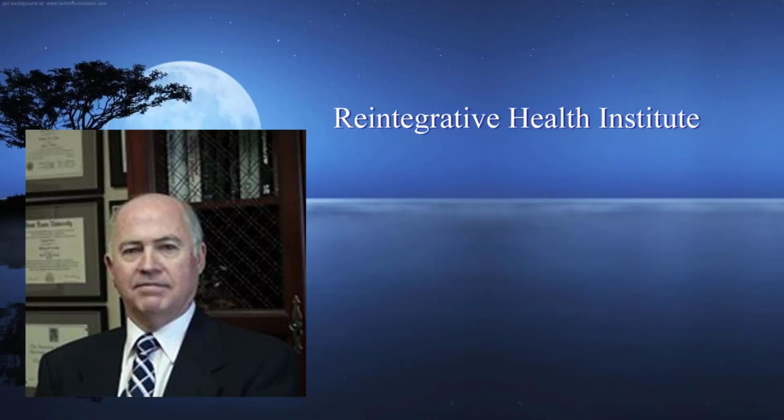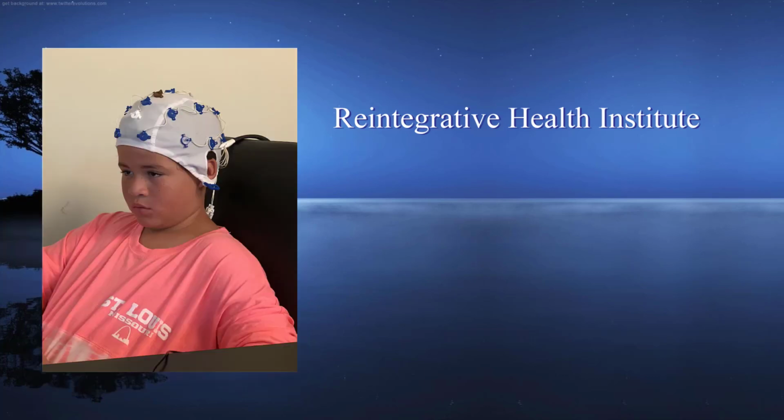My name is Dr. Collins. I'm a board-certified neurotherapist who's been in practice for over 35 years. What I'd like to do now is to give you a brief overview of what quantitative EEG is and how it can help guide neurotherapy. In order to record the electrical activity of the brain, EEG, a special cap is used. There are 21 electrodes that record and then transfer the brain's activity to a program that can compare the recorded EEG to a normative database.